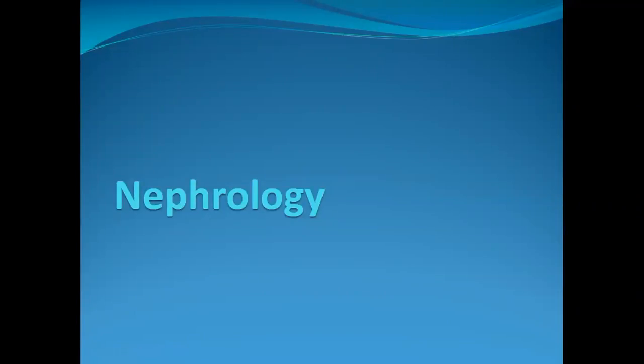Okay, guys, so let's start nephrology week one. In week one, you're going over some anatomy and some basic stuff in your other courses. But we're going to start week one with a review of imaging for the kidney. I'm going to give you examples of different types of examinations that we use for evaluating the kidneys, which are the vast majority of what you'll be using out there.